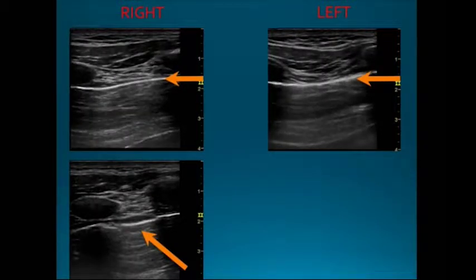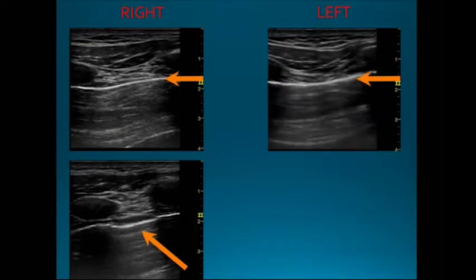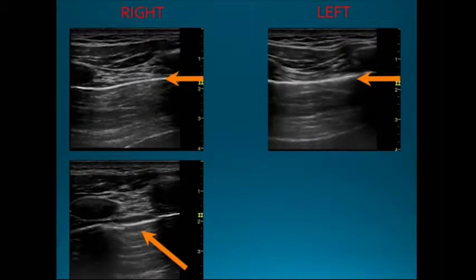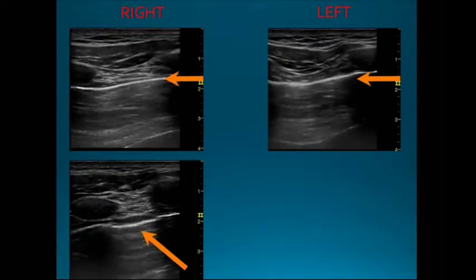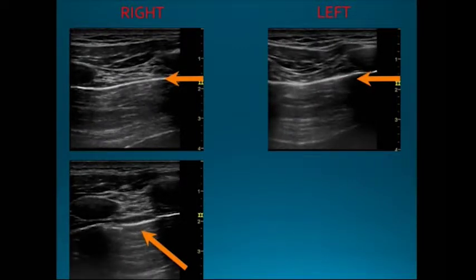And they're like, very concerning. Then they go over here to the left, and they get an image that looks like this. And they're like, okay. They come back over here to the right, and then they slide laterally. They get an image that looks like this, slightly different than this, sort of halfway between this. And they see just this unusual artifact pattern, and they're like, get me a chest tube.